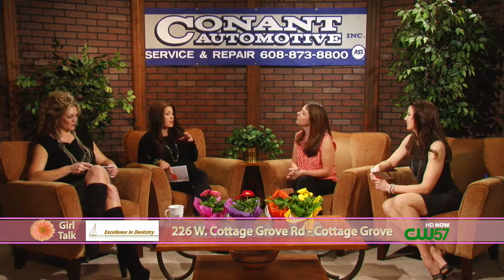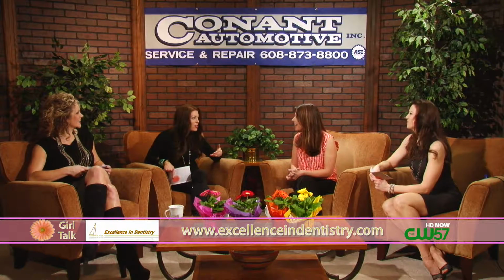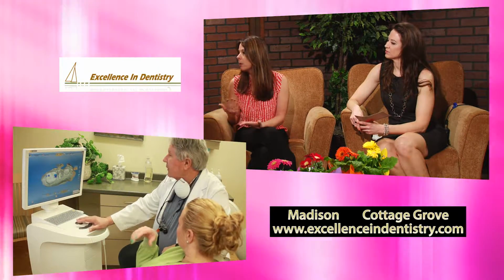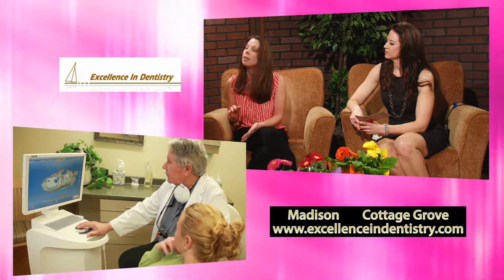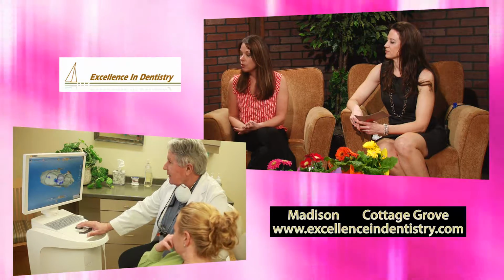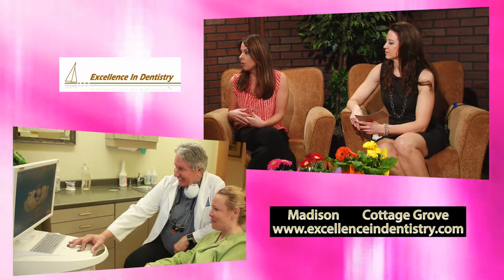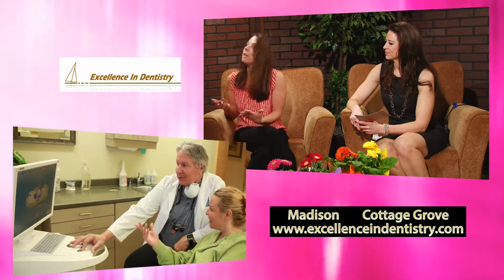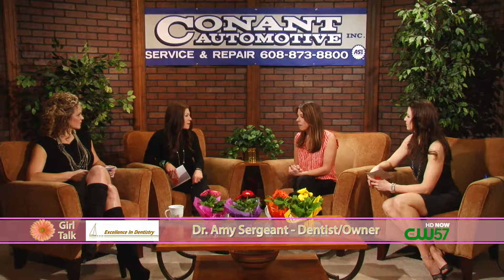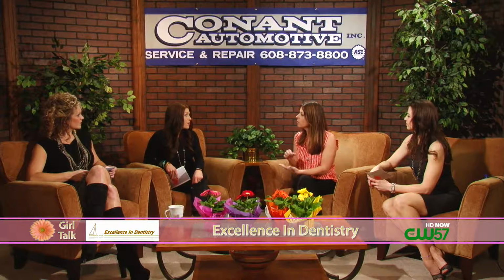Yep, it is. So there's a machine now that actually makes crowns. So that has to make your life easier, and the patients as well. How does that work? It's called the CEREC machine, and some people may have heard of CAD/CAM technology, and that's what it is. It's computer-aided design, computer-aided manufacturing. So it uses that technology to basically create a crown while a patient is still in the office. You may have had a crown before where you have to come back in 2 weeks. Well, this is great for a patient. The machine is chairside, and we utilize a special camera to take photos of the prepared tooth.